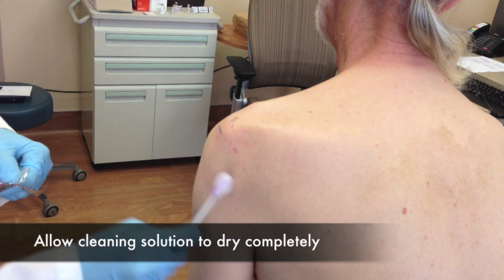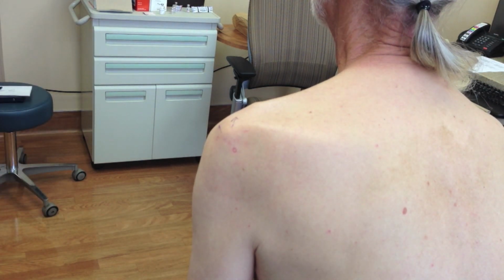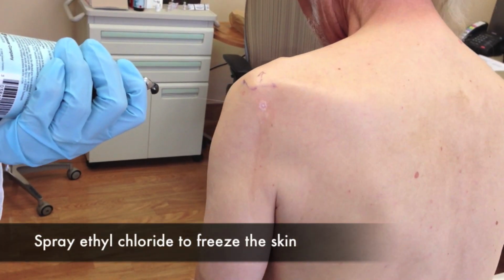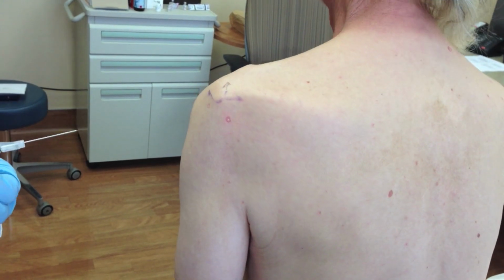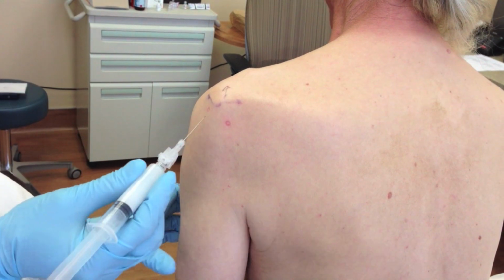This is a no-touch technique using non-sterile gloves. It is critical to identify the landmarks and site of injection prior to prepping the site. To inject the bursa, spray ethyl chloride on the skin overlying your mark until the skin turns white. Again, just before inserting the needle, make sure to shake the steroid in the syringe.